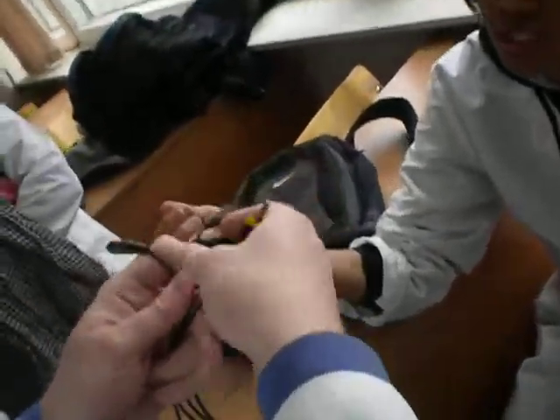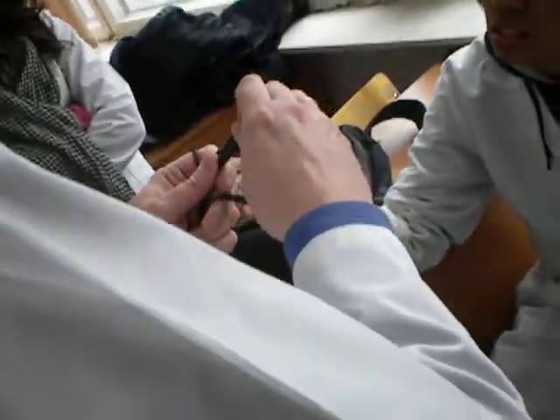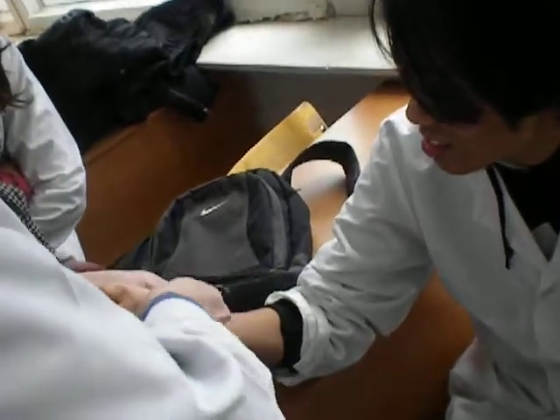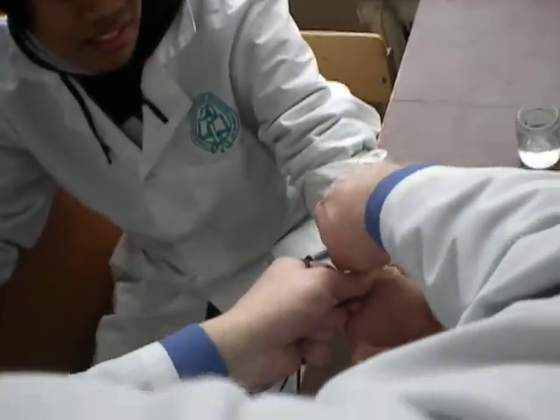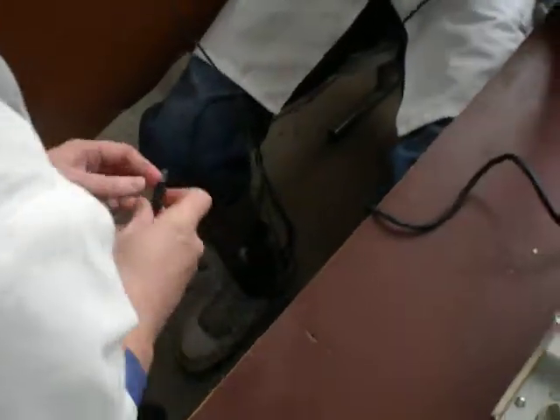And there are red, yellow, green, and black. Red should be joined with the right hand. Yellow with the left hand. Green for the left foot. And black for the right foot.